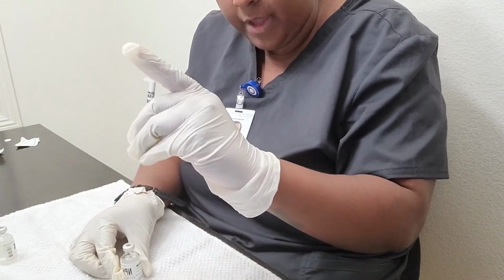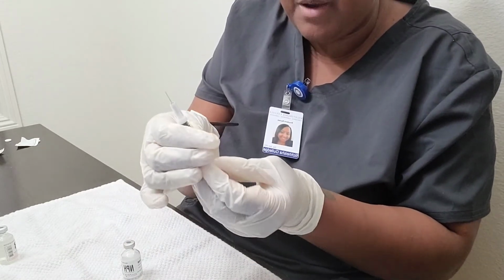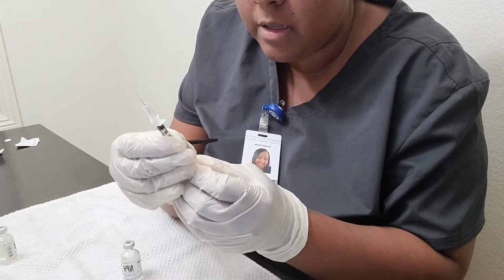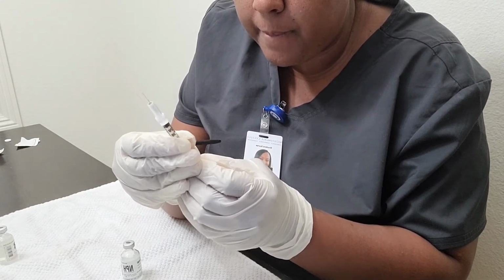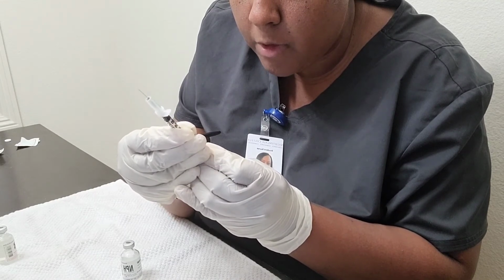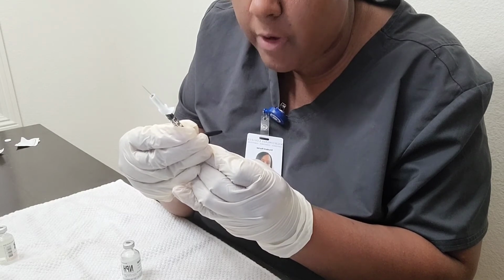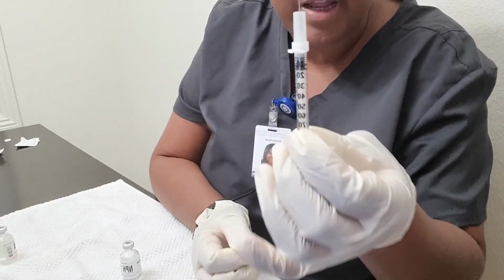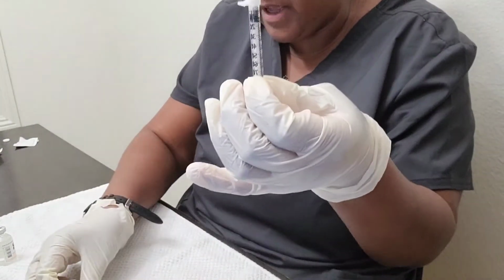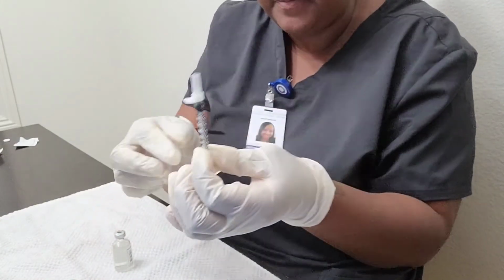And then I'll remove that, and without aspirating, I will now draw up 4 units of air. Okay, so now I have 4 units of air that I will inject into the regular insulin.